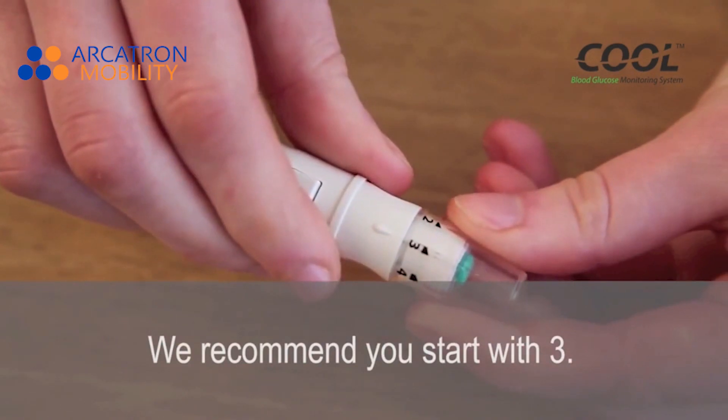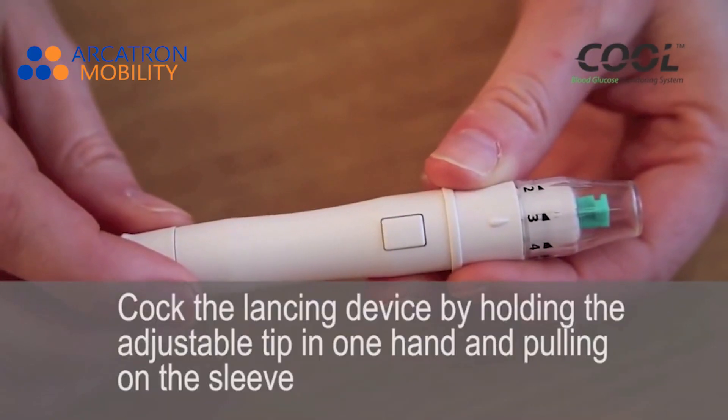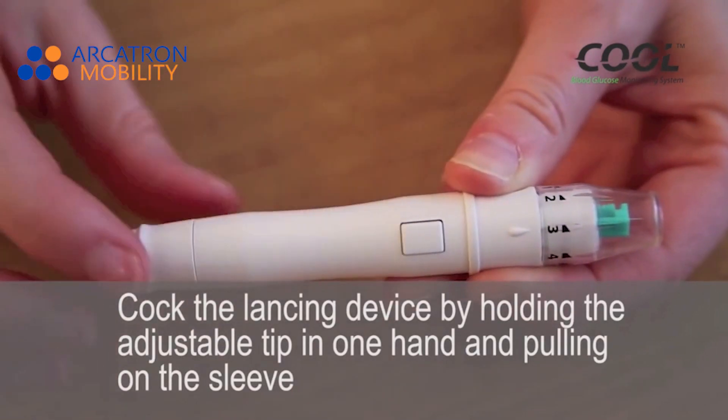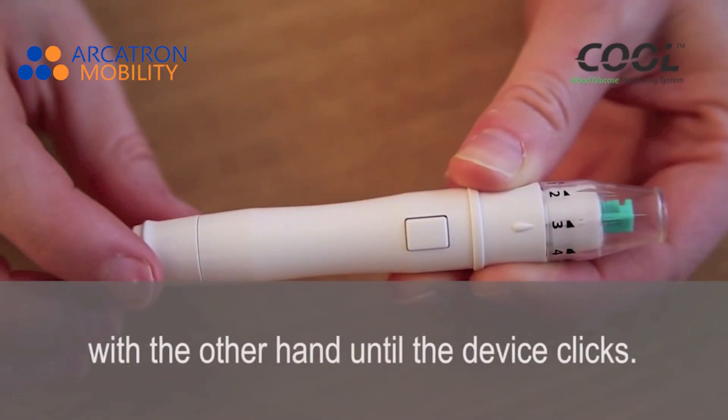We recommend you start with 3. Cock the lancing device by holding the adjustable tip with one hand and pulling on the sleeve with the other hand until the device clicks.